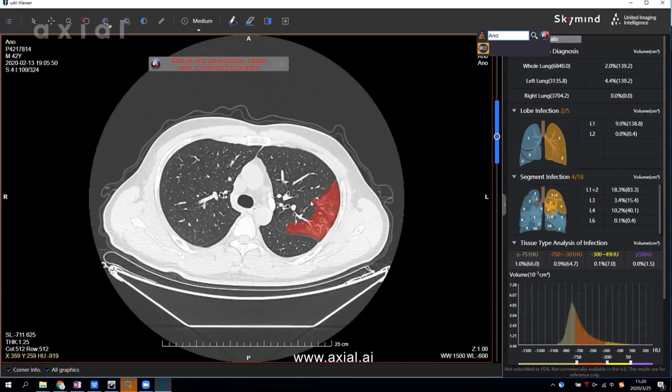You can also turn it on and off to see if this is a real finding or a false positive.